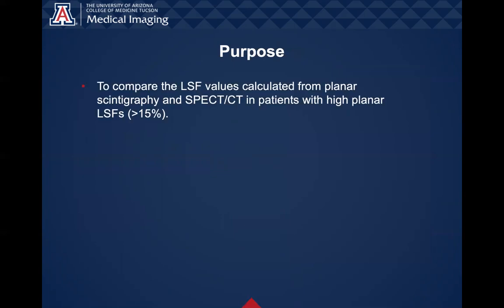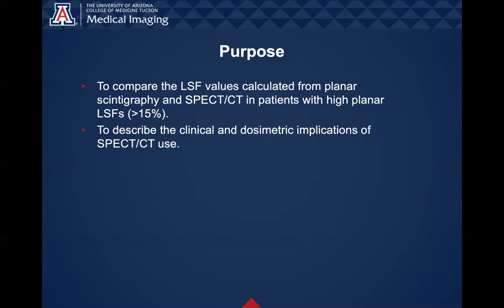The purpose of our study is to compare the lung shunt fraction values calculated from planar scintigraphy and SPECT in patients with high planar lung shunt fractions, or an LSF greater than 15%, then to describe the clinical and dosimetric implications of SPECT use.